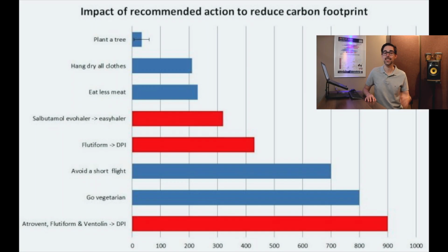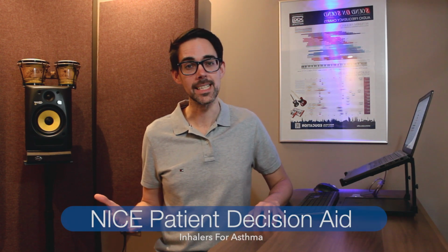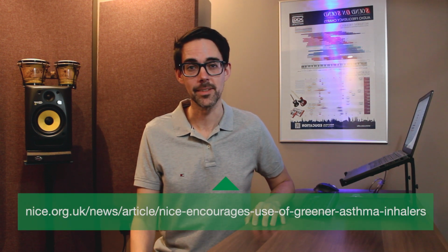Regardless of how wimpy that is, I was inspired by this image that we're showing all third-year medical students at their asthma teaching. And this is from greeninhaler.org. The massive carbon footprint reduction by changing a patient's pMDI to a DPI is quite spectacular. And here's what NICE has to say about this. A NICE patient decision aid was released in April of 2019 to help patients better understand the environmental impact of the inhalers they use. And you can signpost your patients to this if they want to have a read.